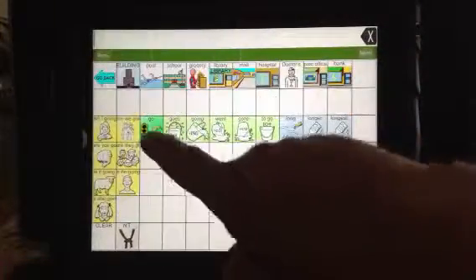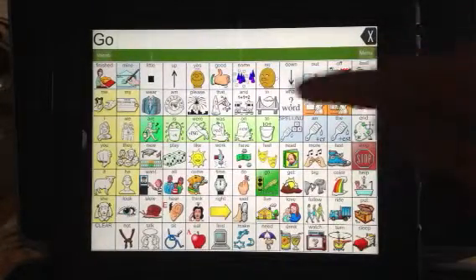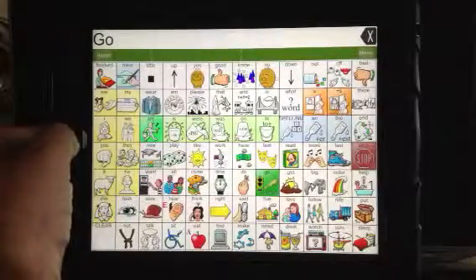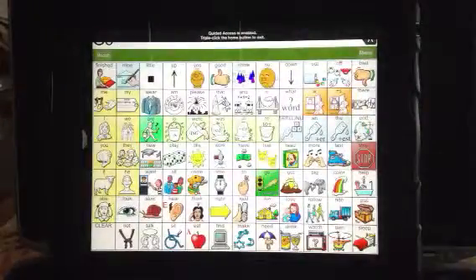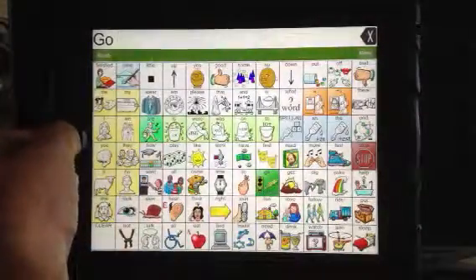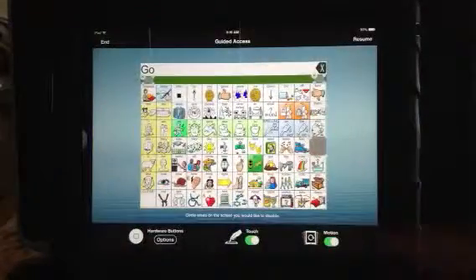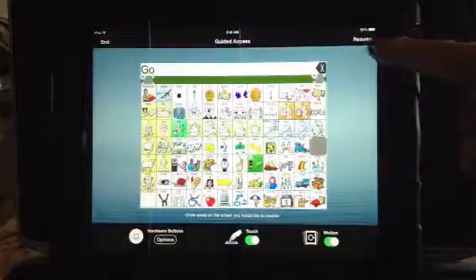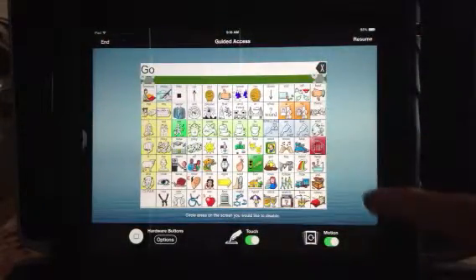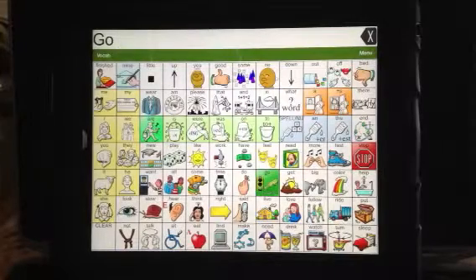Now everything else works fine, so the child can talk and use the device. But because I've turned on Guided Access, he can't get out of the app. Even this Home key doesn't work — when he tries to hit it, it says you have to triple-hit the button to turn off Guided Access. And it's a little harder than that: even when I hit it three times fast, I have to know the password to get out of it. Then you just say End. If I hit Resume I'm right back to where I started, so I'll tell it the stop sign works again and then say End. That's how you set up Guided Access to keep a child in the LAMP Words for Life vocabulary.